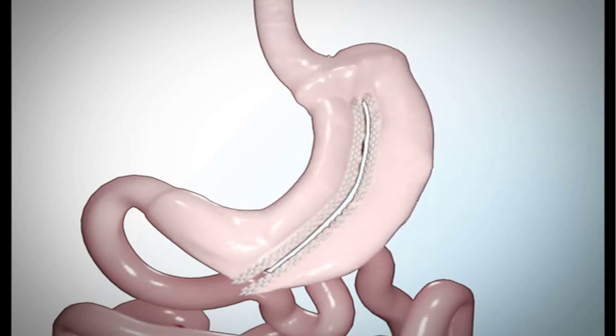The second step is dividing your stomach into two sections. Your surgeon will divide your stomach using an endoscopic stapler. Your surgeon may also use traditional stitches or a combination of both staples and stitches to seal each section of your stomach. This seal is called the suture line.